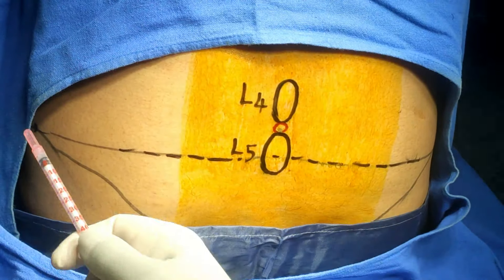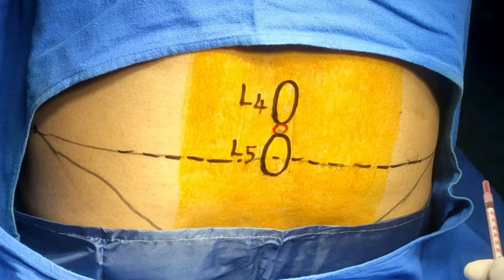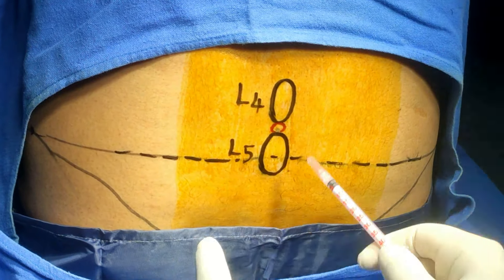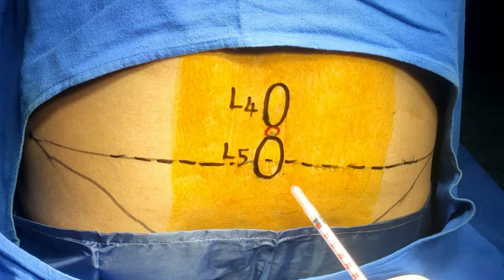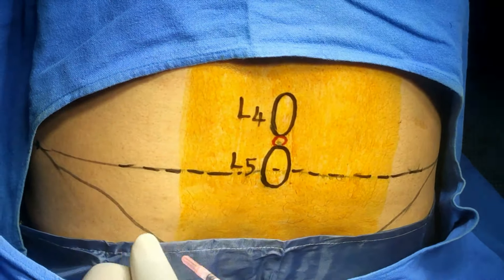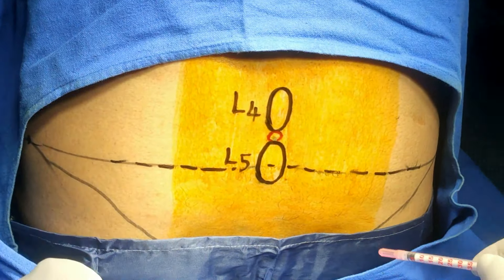If you draw a line from the top of the iliac crest, this line passes nearly at the L4-L5 level. So this is L4, this is L5 spinous process, and I have marked the oblique line.